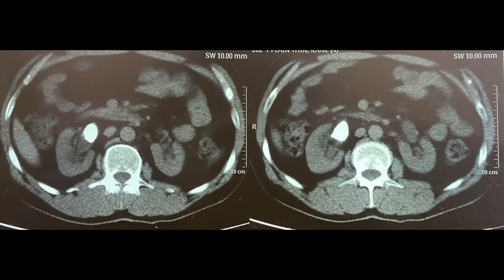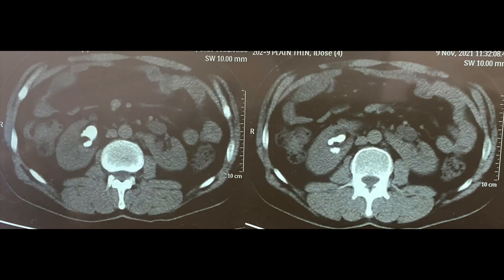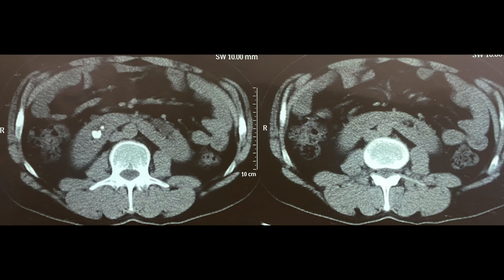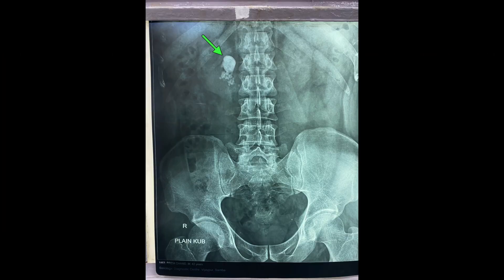In the image provided you can see a large hyperdense stone found in the right renal pelvis, and also small secondary stones were found in the inferior calyces of the right moiety. In a horseshoe kidney, he subsequently underwent an IVP where you can clearly see the large pelvic stone and associated multiple small secondary stones located in the inferior calyx.